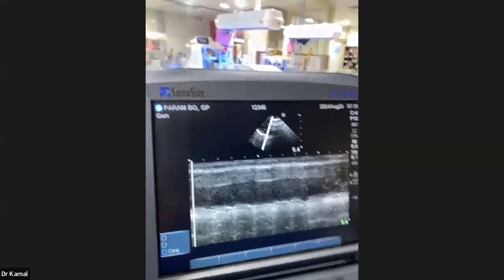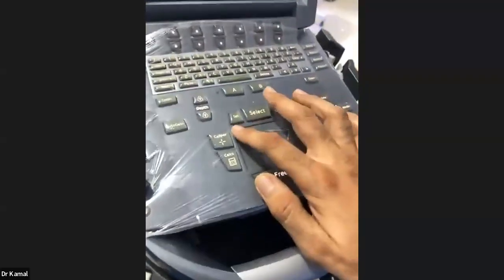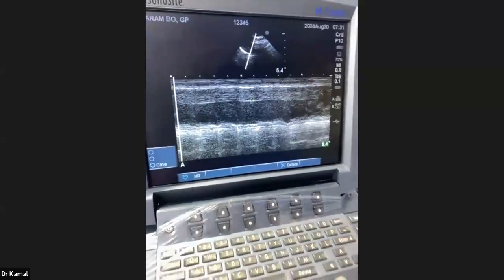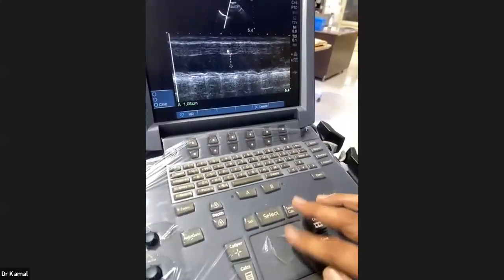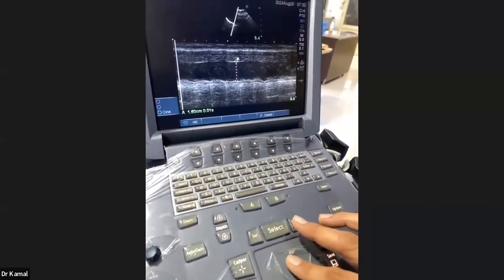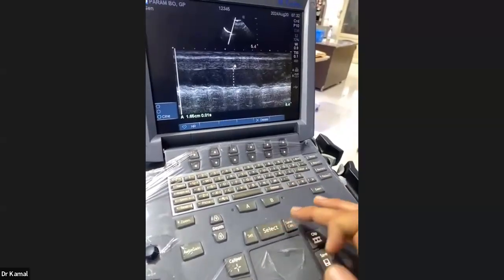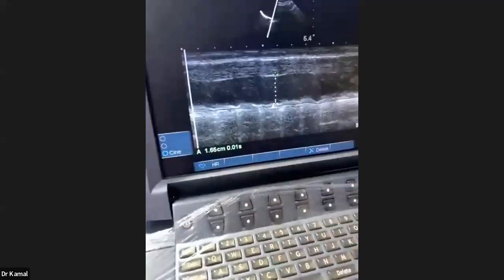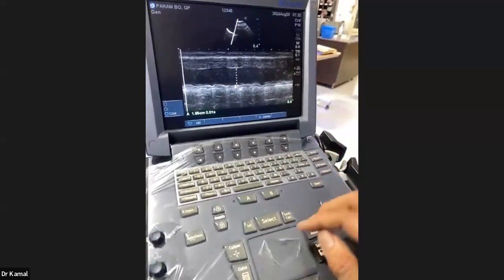So there are modes, and some measurement has to be done. If I press the caliper button once, a plus sign comes over here, which is one marker. It takes this as a point, and I measure this dimension with a second mark. Fine. Now I can select this and save this. So between 1 and 2, the measurement is 1.65 centimeters, so it is 16.5 millimeters over here.